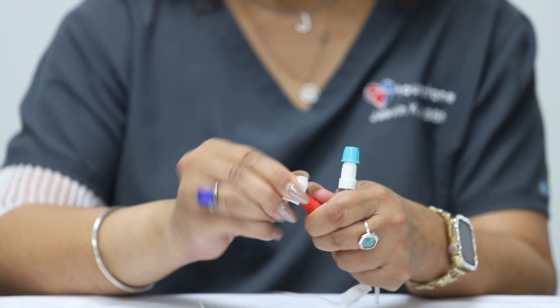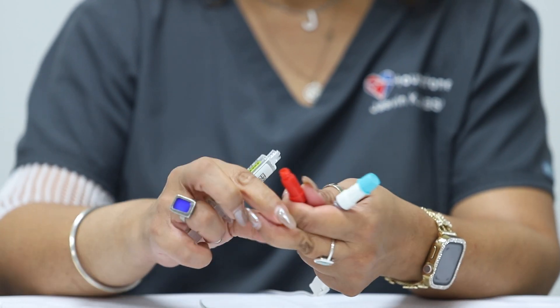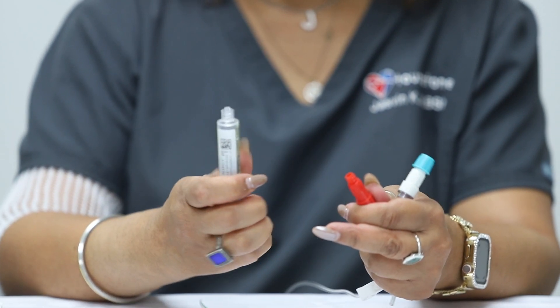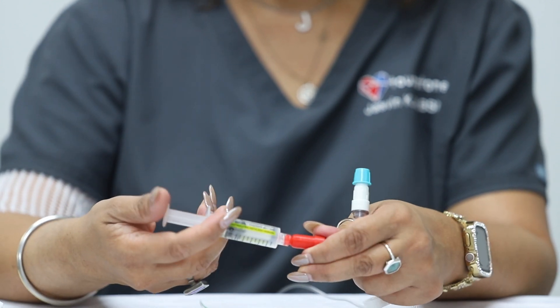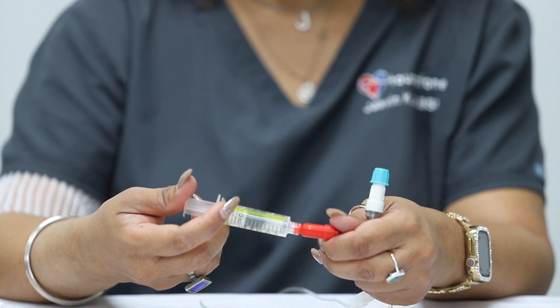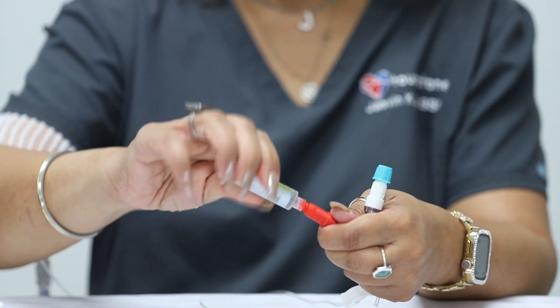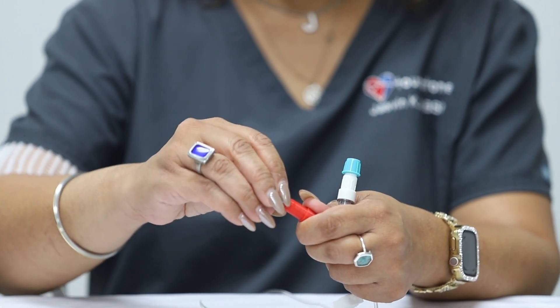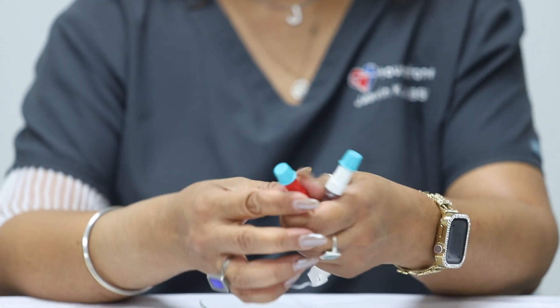Wipe your IV line with an alcohol wipe for at least 15 seconds. Uncap your heparin and pull back the plunger to allow air to enter the syringe. Push the plunger up slowly to allow a few drops of heparin to drip out of the tip of the syringe. Attach the syringe to your IV line. Flush your IV line by pushing the syringe plunger until all of the heparin has been administered into your line. Disconnect your heparin syringe from your line and discard in the normal trash. Lastly, recap your IV line and tighten the clamp.